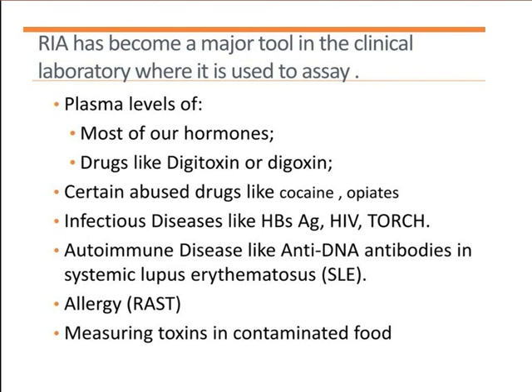Now, how can you measure radioactivity? Radioactivity can be measured by measuring gamma radiation using a gamma counter. So, this finishes radioimmunoassay. There are some disadvantages of this technique, that is, there will be handling hazards because you are handling radio labeled antigens, because iodine 131 and iodine 125 can emit gamma radiation. So you require special counters for measuring them.